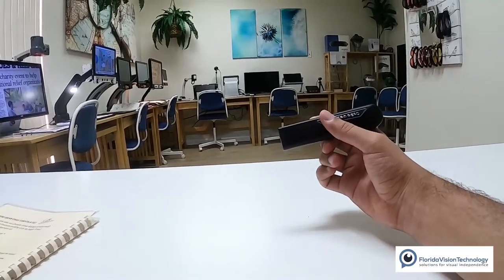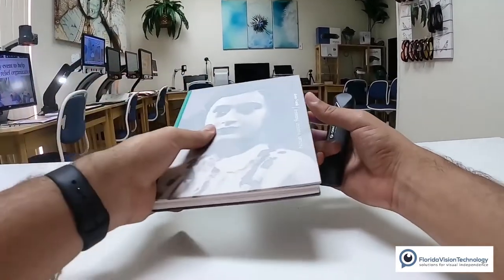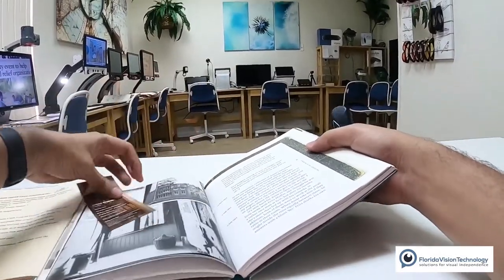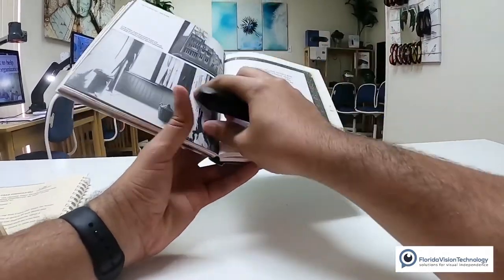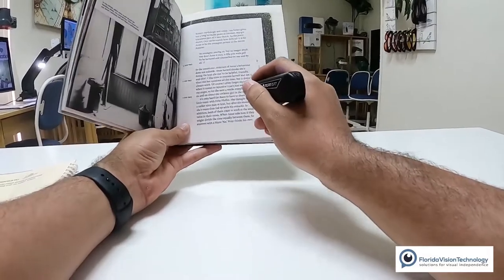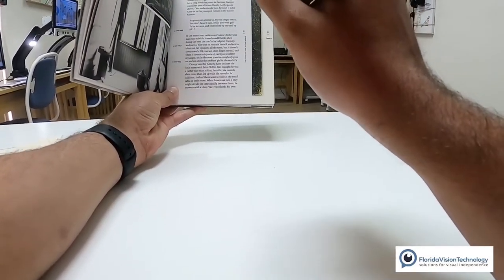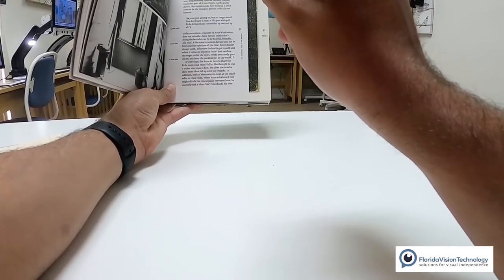I have three different things I want to read today for my examples. One of them is going to be a book — let's say you're sitting at home and you're just reading a book for pleasure. So I have my hard copy book in front of me. I'm opening it up, I'm holding my OrCam in my hand, and I'm going to hold it back about 12 inches from the book. I'm going to press that trigger button — there we go, took a picture.